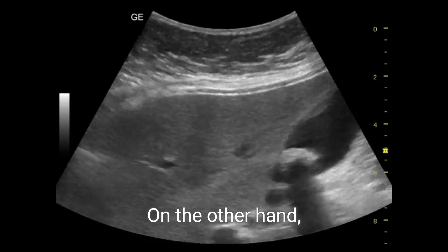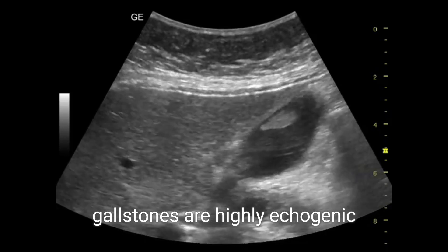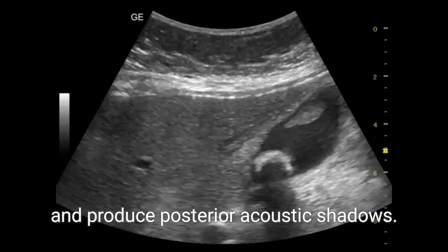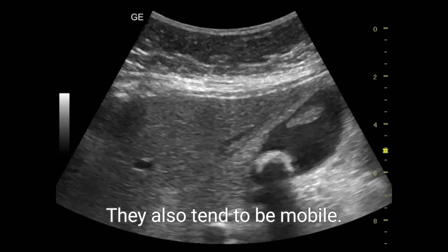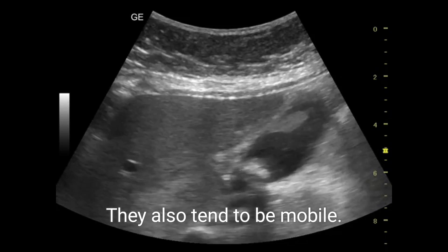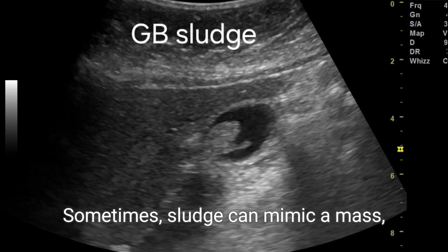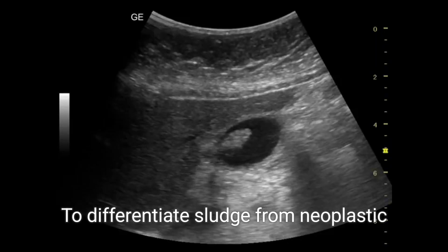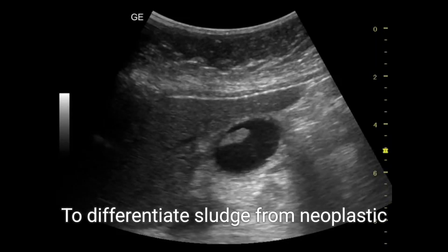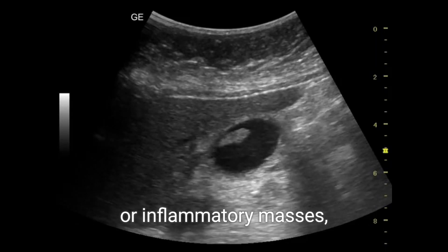On the other hand, gallstones are highly echogenic and produce posterior acoustic shadows. They also tend to be mobile. Sometimes sludge can mimic a mass, complicating the diagnosis to differentiate sludge from neoplastic or inflammatory masses.